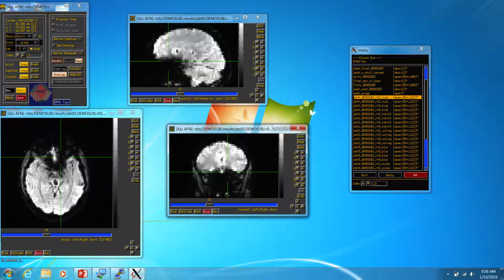It's not as bad as it looks, but basically the thing that's right below your frontal lobe is your nose. And the thing about your nose is you have air passages in it. The rest of your brain is basically encased, more or less, in liquid, so it has a similar kind of characteristic. But your nasal passages, because there's air in there, end up disrupting the image a little bit. So there's a little bit of distortion.